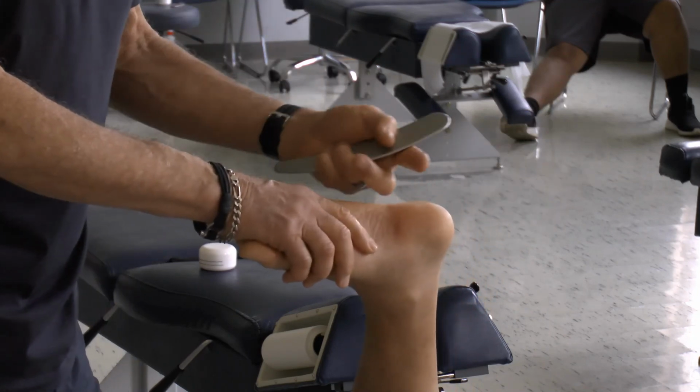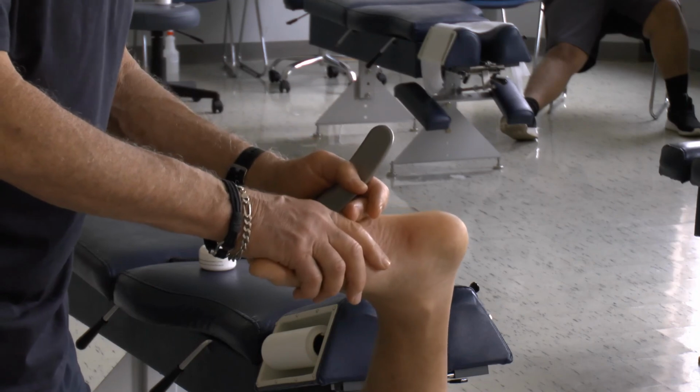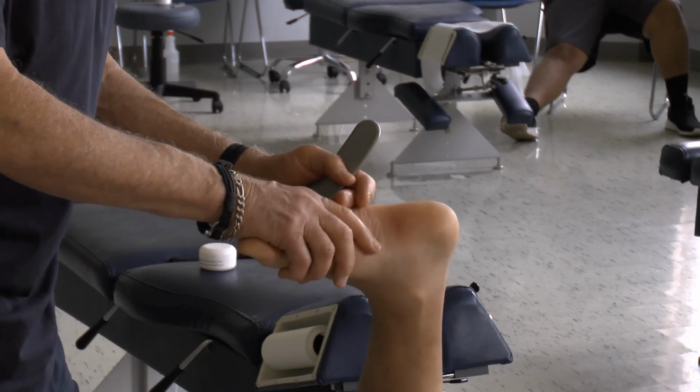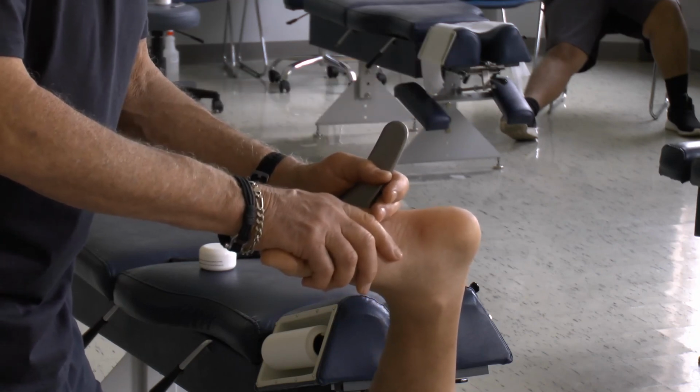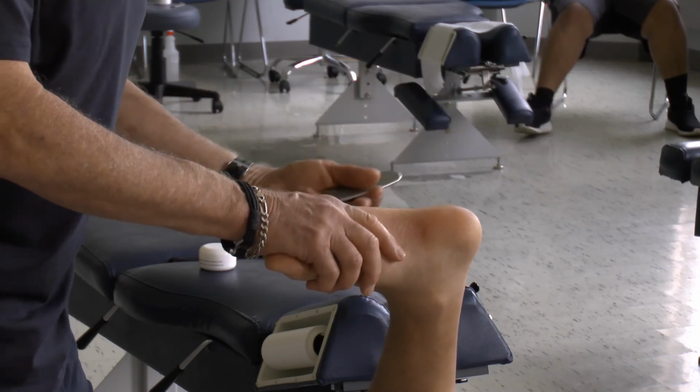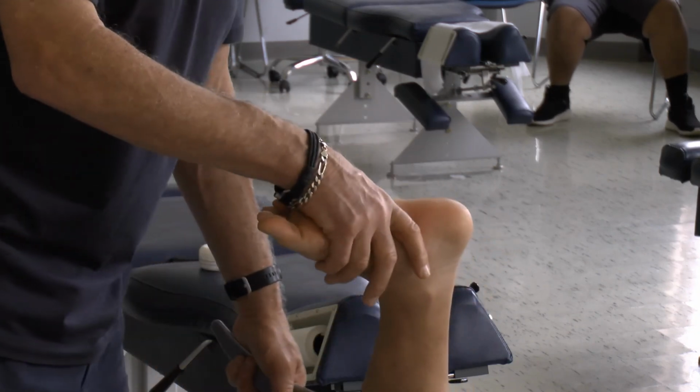Okay. And you know, treatment probably typically wouldn't last as long as I was just demoing it, I just wanted to show the maneuver to the camera. But patient tolerance always rules. You're always better off a little less than too much in the beginning, especially if you're not sure how they'll react.